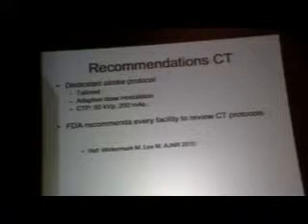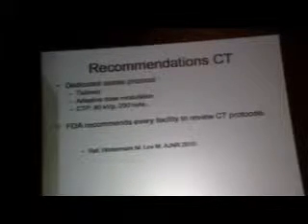Hence, in this month's AJNR, Lev and Wintermark made some recommendations that we should have dedicated stroke protocols that are tailored to certain settings as listed. And each CT protocol should be reviewed. A CT perfusion protocol, in their estimate, can be protocoled such that the radiation dose is equivalent to an extra CT scan.